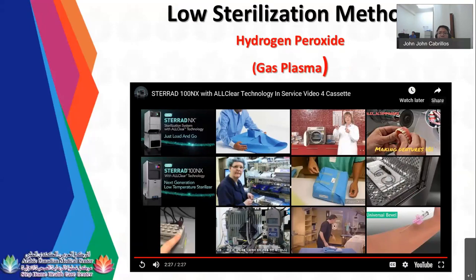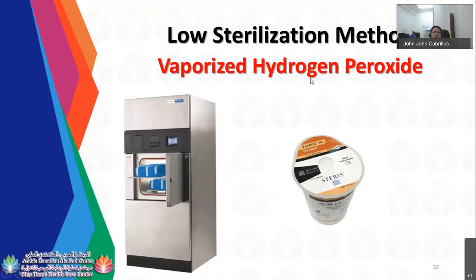So this is your sample of your vaporized hydrogen peroxide. It is the same concept, but it uses a different sterilant, which is your vaporized hydrogen peroxide.